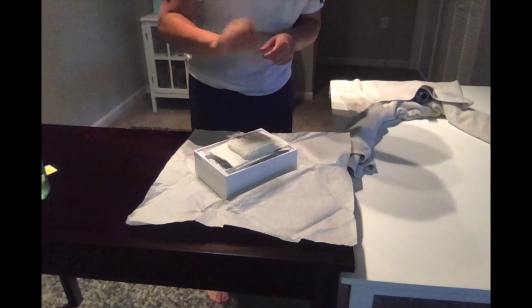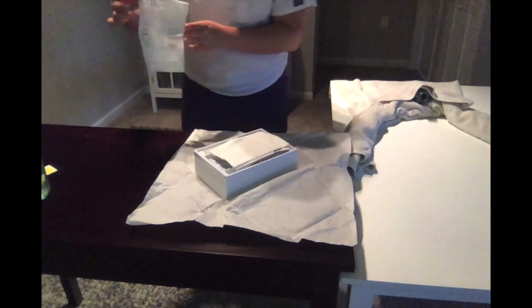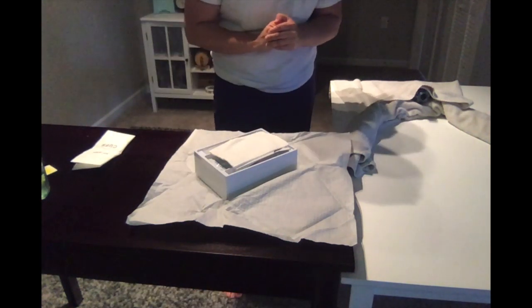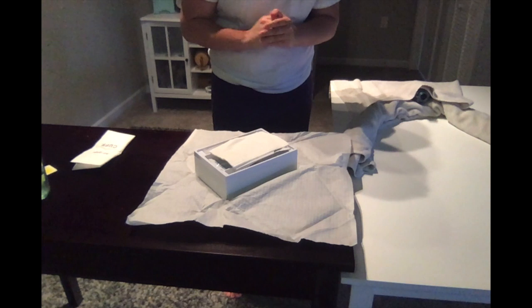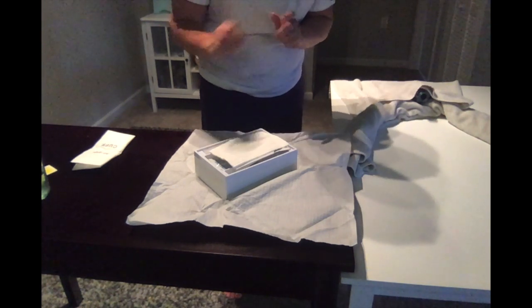So then I'm going to go ahead and take my gloves out, and I can just place them right here on the side, and then I can take this top drape right here and I'm going to put it on, do that shiny side down.